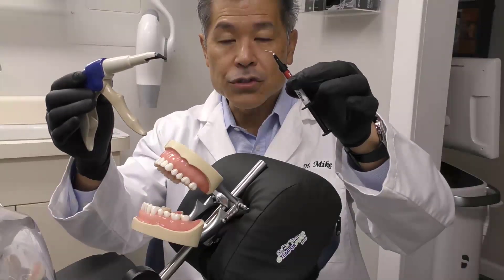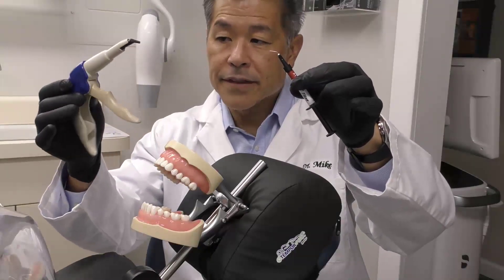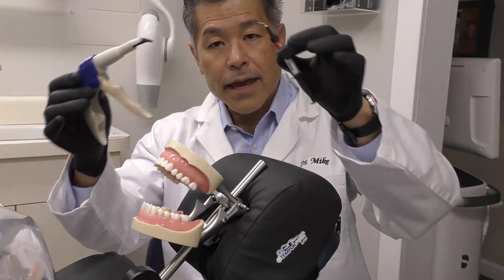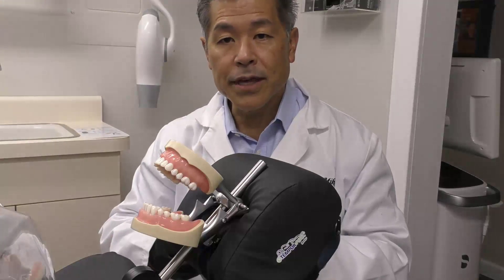But what if we could take these two — the properties of the sculptable and the properties of the flowable — and combine them? How do we do that today?